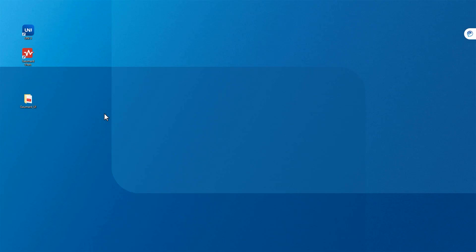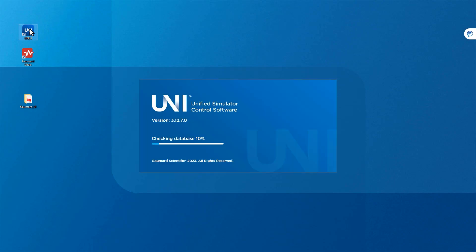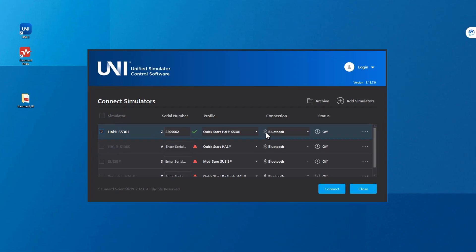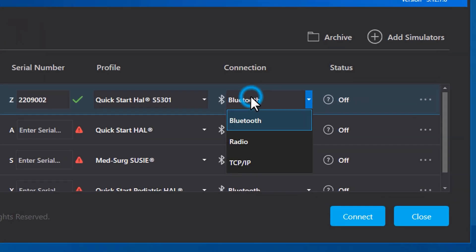Finally, let's connect to your simulator using a GoMard RF dongle. Insert the RF dongle into the tablet and open the Uni3 software. On the simulator selection page, click the box next to your desired simulator.